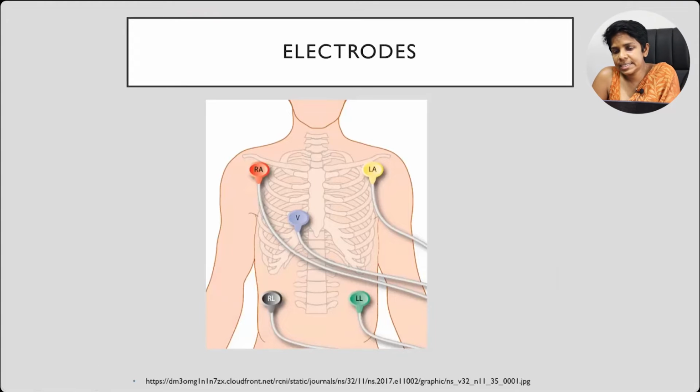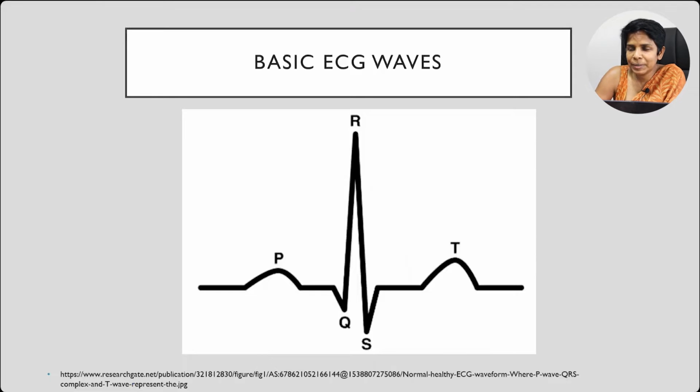So these electrical activities are detected by the electrodes which are placed over the skin, and there are several kinds of electrodes. They look at the heart in different planes and different angles. According to that, we get various patterns of ECGs. So, even though my topic is ABC of ECG interpretation, it should be PQRST of ECG interpretation, because the waveforms in ECG start with PQRST.